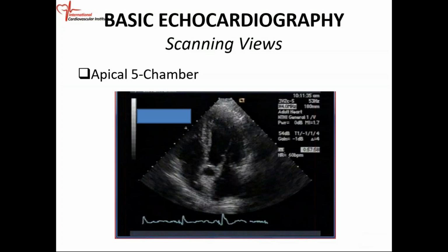All right. So when we're doing a transthoracic echo, we usually start with the parasternal long axis view. You get your probe, and you either put the patient on the left side, or some technicians will do the patient lying flat. There are different techniques of doing your scan.